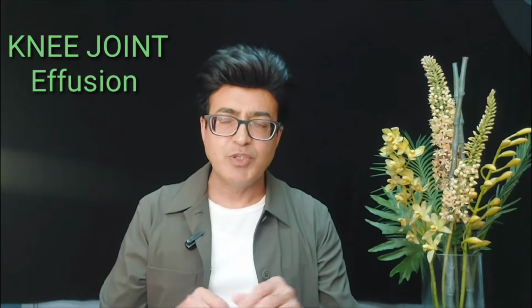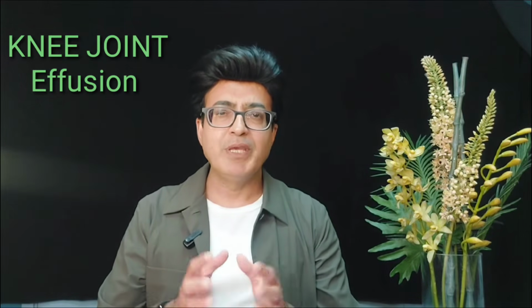You just watch this video and I'm sure you will be able to pick the joint effusion so far as its diagnosis is concerned. And beside this, I have also focused on how to write the report, and how you will shape your diagnosis and what would be the next modality. So let's start watching this video.